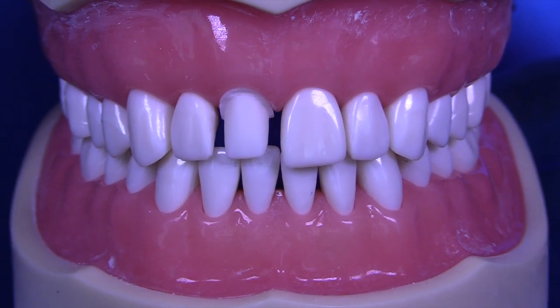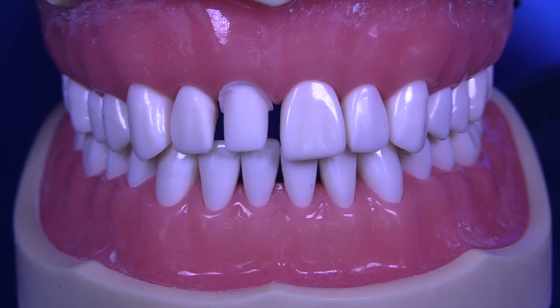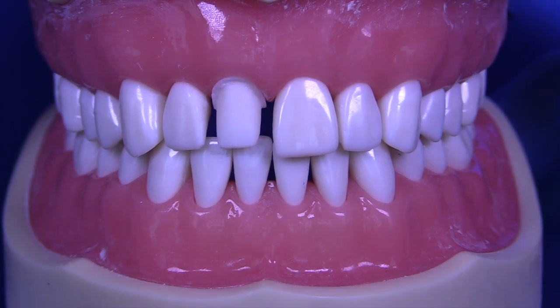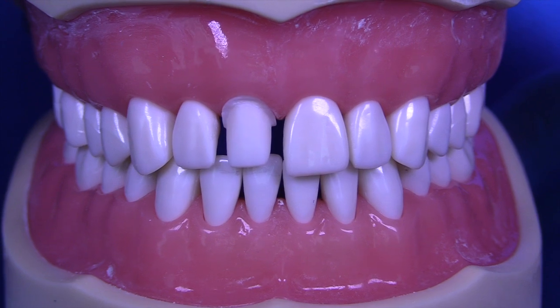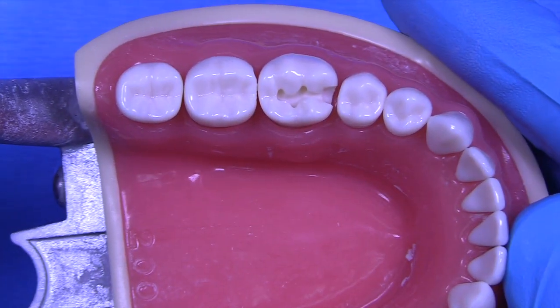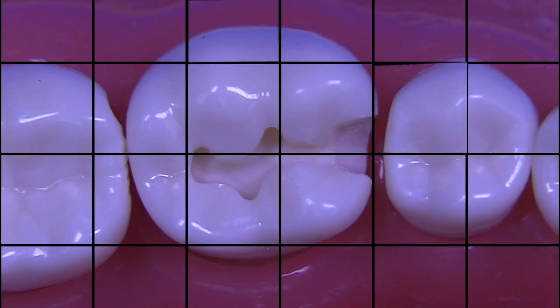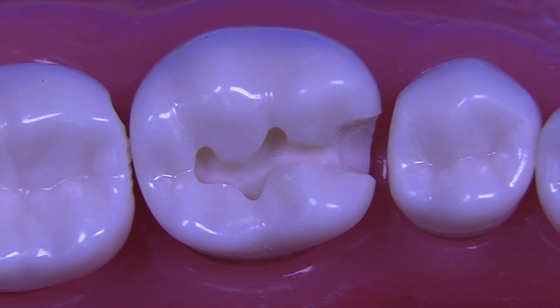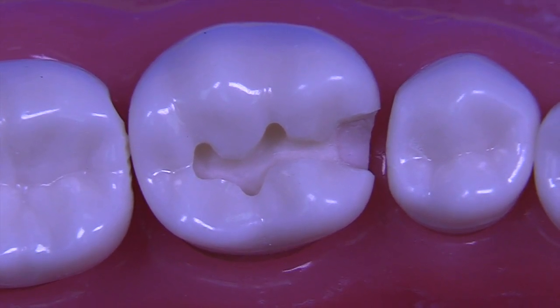Okay, Dr. Stevenson here, and we're going to evaluate a typodont that's been submitted for a mock exam. And the assignment was number 8 PFM and number 19 MO Amalgam. I'm going to give you grading on both these preparations based on the system that we've been using for a long time.